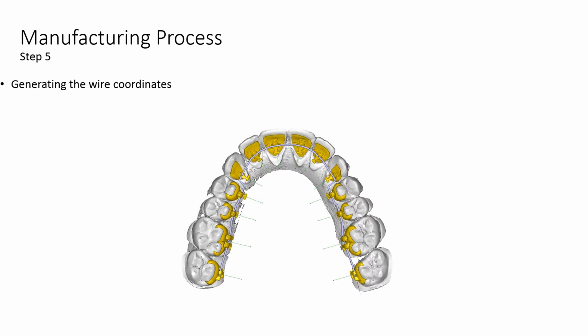But all these first order bends are also problematic, because a first order bend, like a bend in the horizontal, will cause friction and binding, which we talk about in the fixed appliance module. So there are other techniques out there which have a straight wire approach, like the edgewise approach in the buccal system.